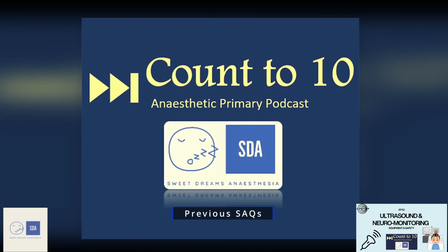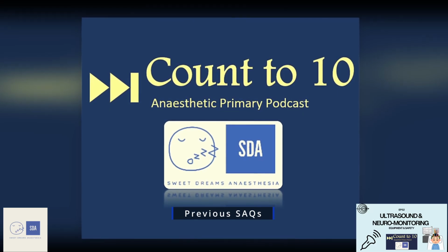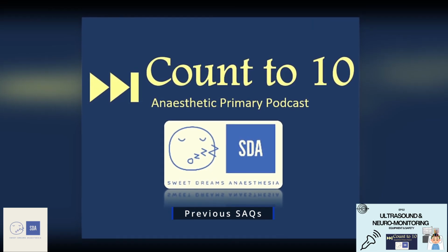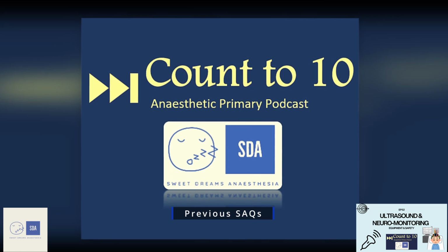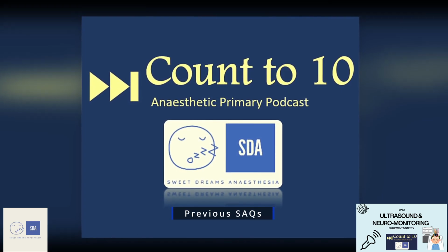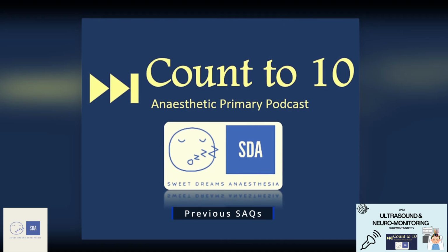And for cardiac output, where you want to measure it is at the left ventricular outflow tract. And this will then let you go on to how you can use Doppler to measure cardiac output. So we've already mentioned how we're going to figure out heart rate. Now we need to figure out how we're going to measure stroke volume. And stroke volume is measured in mils, and there's no one method on ultrasound which allows us to straight away get a volume. To get a volume on ultrasound, we need to have two things. We need to have an area and we need to have a velocity. And we can calculate both of these things on basic ultrasound.